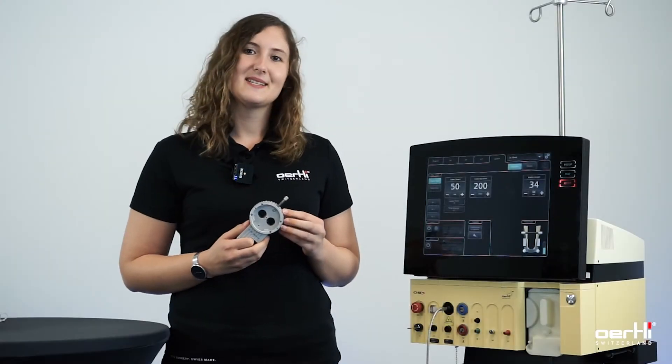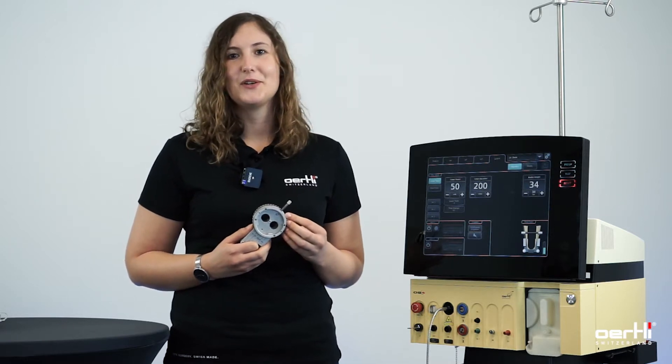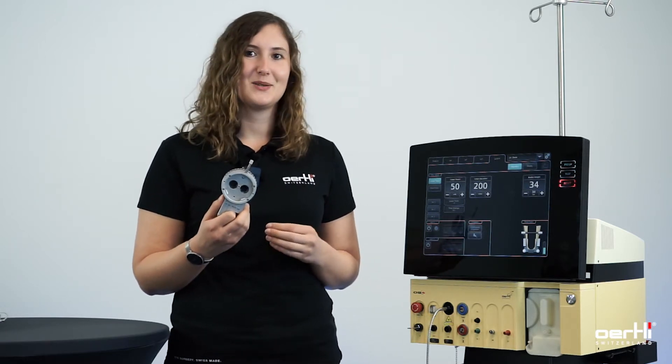Hi, my name is Lisa and I'm the product manager Retina here at Oertli. Today I'm going to show you the new fully automated laser user protection filter.